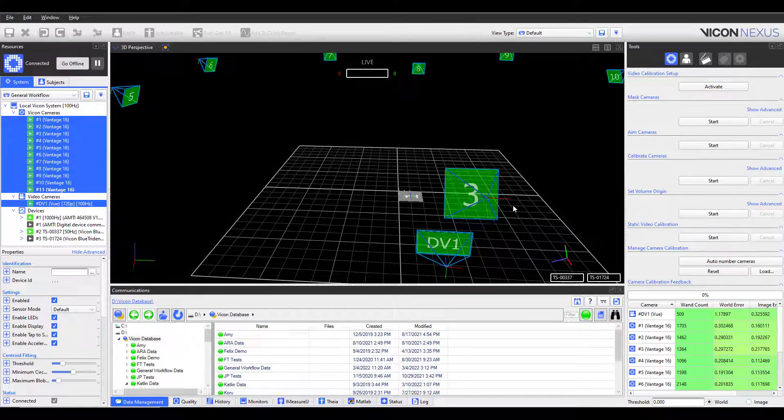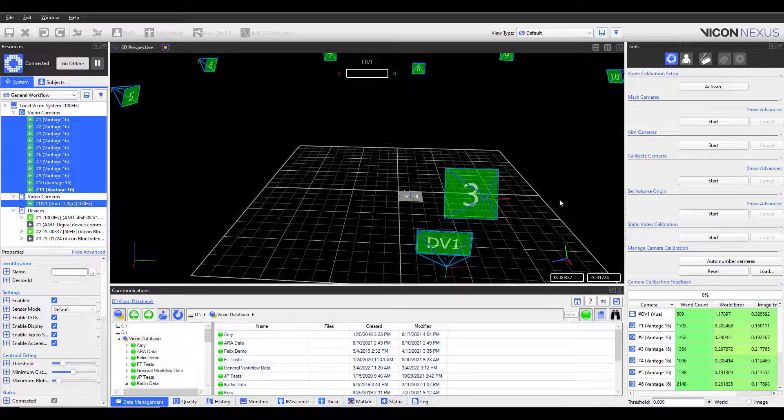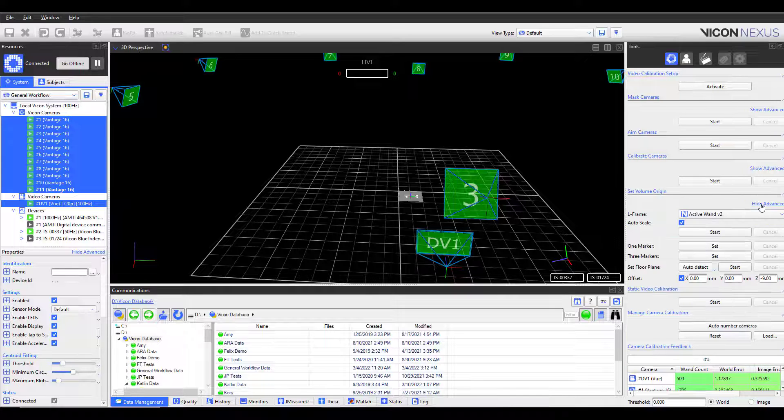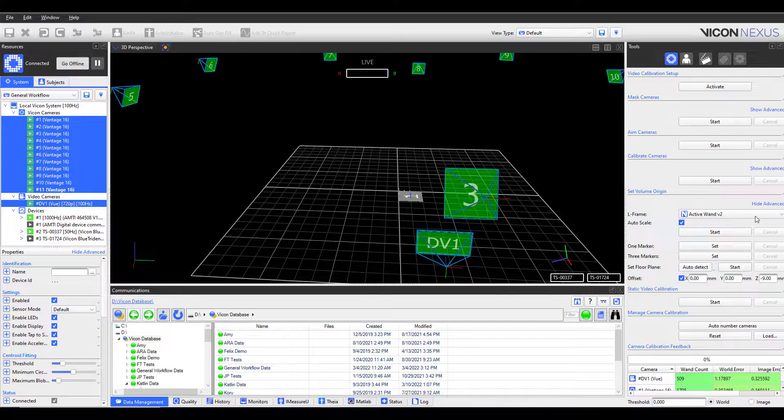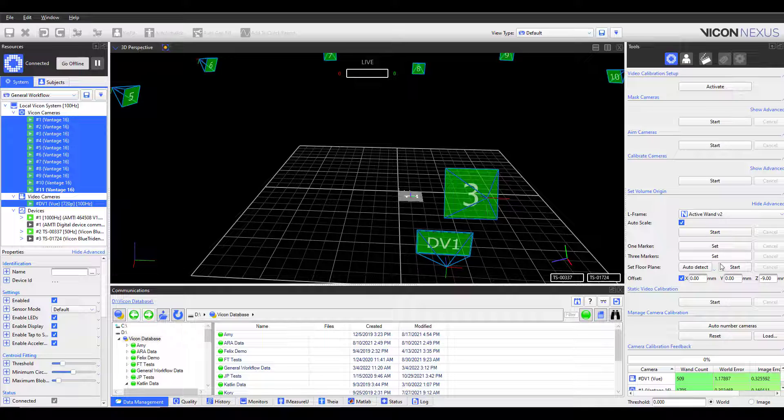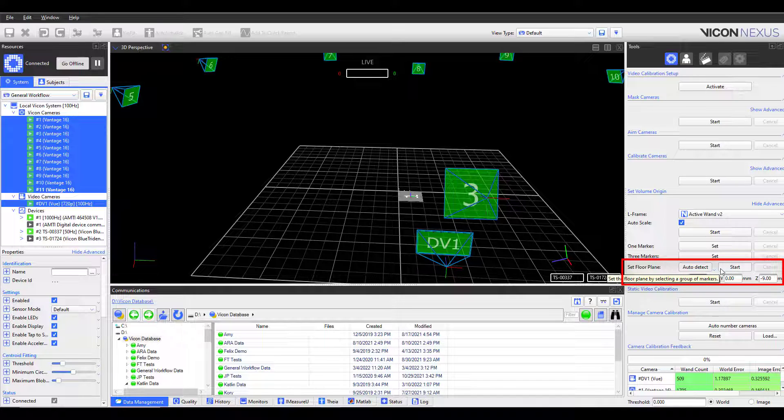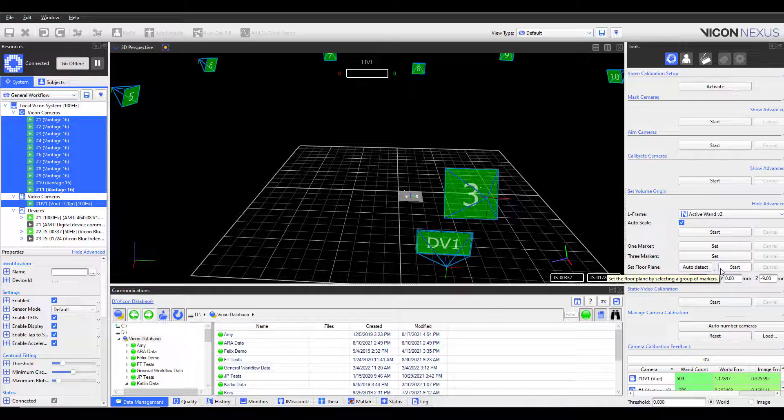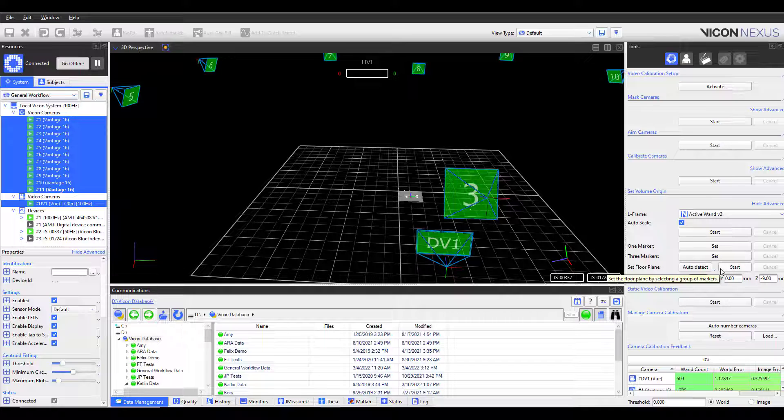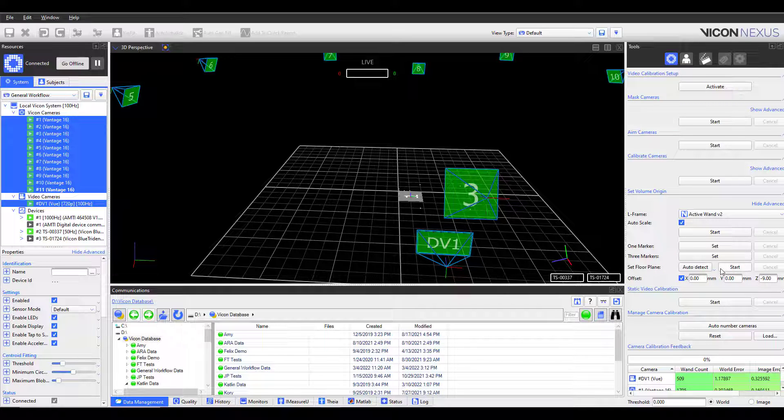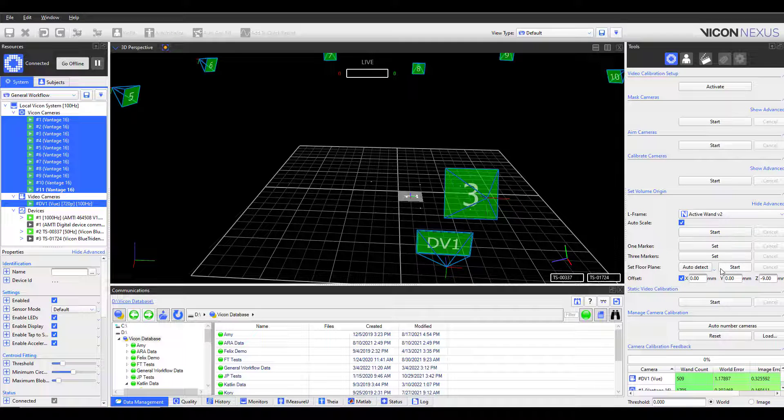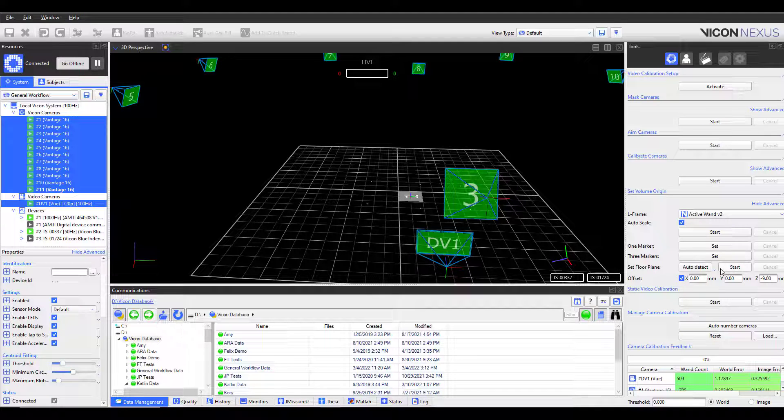It is typically recommended to set the floor plane by using markers placed throughout the volume, rather than relying on the levelness of the wand. You will find this option in the Advanced Set Volume Origin section. I will remove the wand and place 6 markers around the center of the volume.